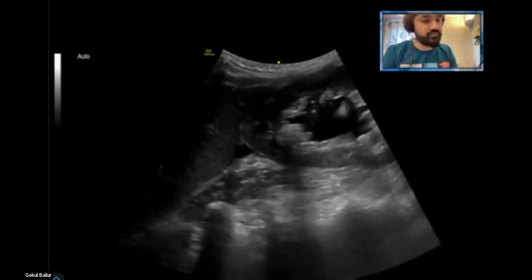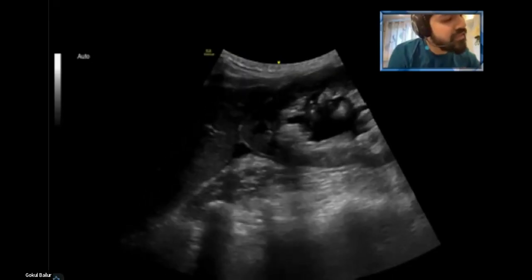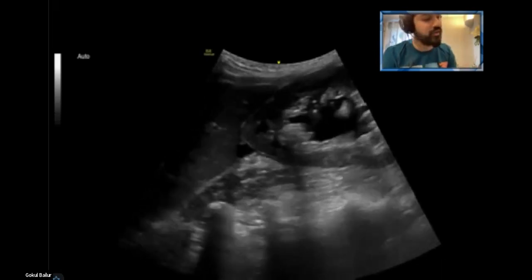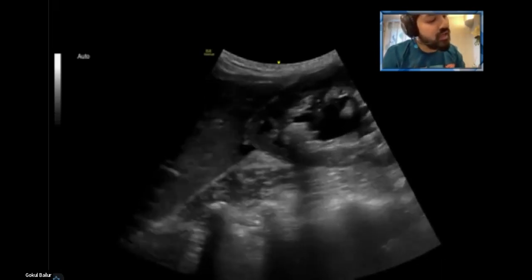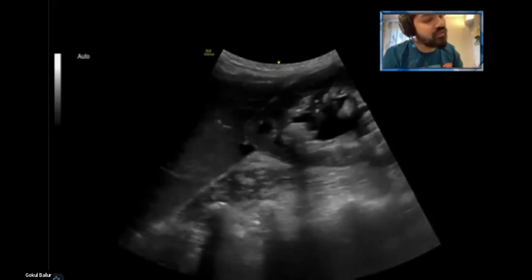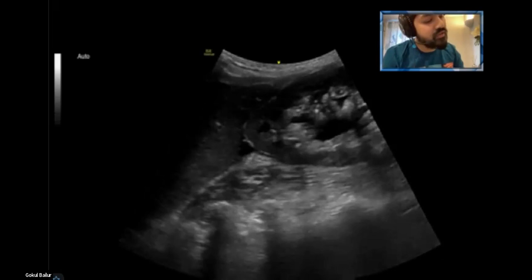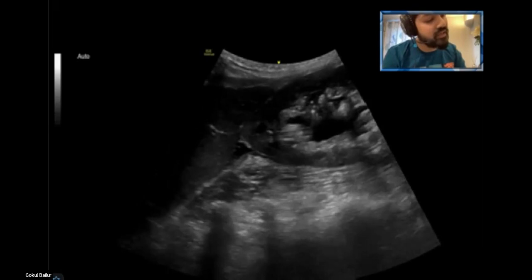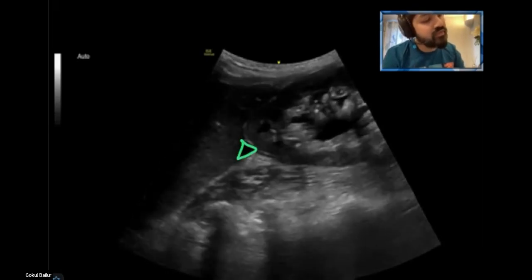This image. The pelvis looks dilated. Yeah. And the calyces are opened up, so maybe moderate hydro. Is there a bit of free fluid in the pouch as well? Yeah. Anything else? You're absolutely correct about the dilated pelvis. Looks like there's some dilatation of the pelvis there. There is a bit of free fluid just between the liver and the kidney, this triangle of free fluid there.